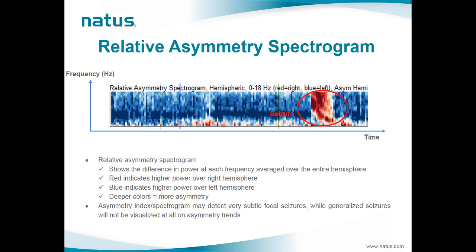The asymmetry spectrogram is similar to a color spectrogram, with frequency on the y-axis, time on the x-axis, and color representing power, but shows the difference in power at each frequency from 1 to 18 Hz averaged over the entire hemisphere. If there is more power on the right at a particular frequency, the spectrogram shows more red signal; if more power on the left, it shows more blue. Perfect symmetry would show no color. Focal seizures over the left hemisphere will be represented by an increase in blue color, while focal seizures over the right hemisphere are represented by an increase in red color.